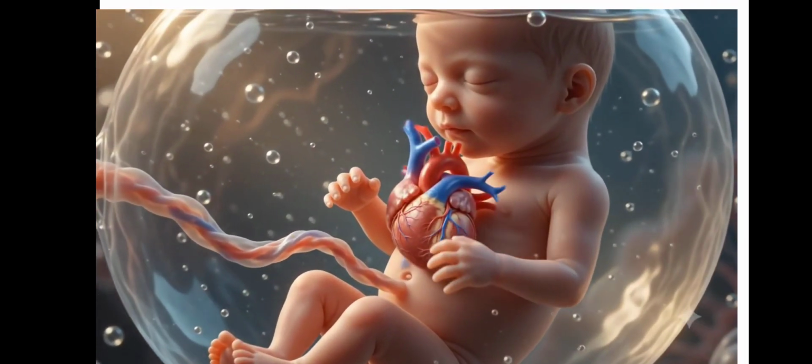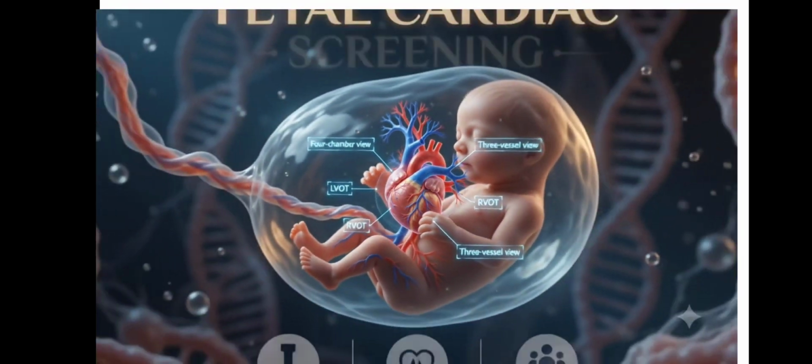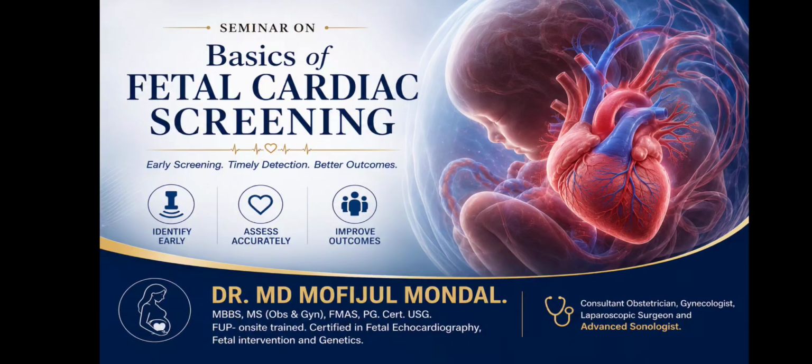Based on ISUOG guidelines for second trimester examination, the goal is not to become a fetal cardiologist overnight, but to learn a systematic approach that helps us identify normality and recognize abnormalities with confidence.